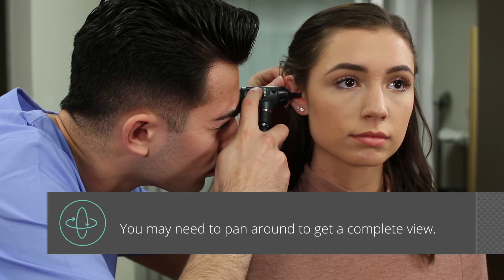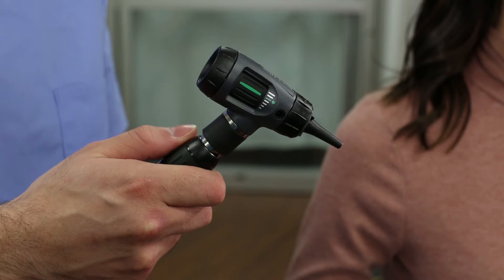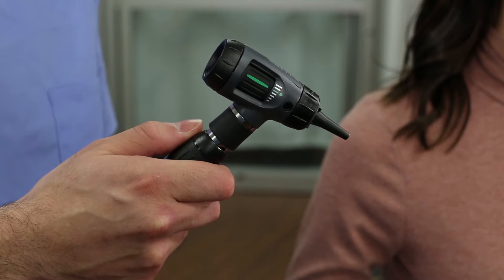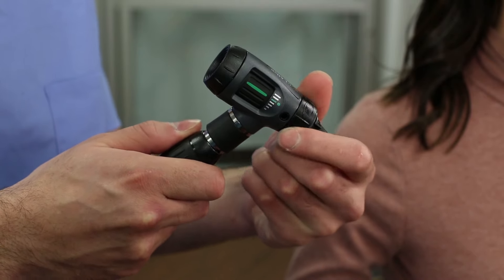Adjust the focus wheel during the examination if necessary. With a basic otoscope you may need to pan around more to get a complete view. After the examination, the used disposable speculum should be removed and discarded.